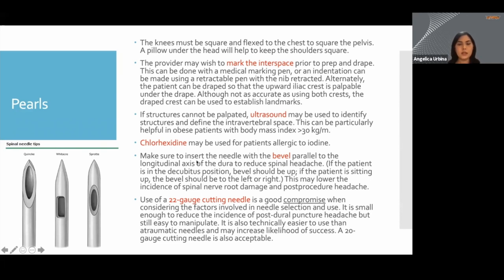Now let's talk about needles and the bevel of the needle. This needle here is classified as a cutting needle — the bevel is facing one direction. The easiest thing to remember when performing a lumbar puncture is to face your bevel towards the patient's flanks. The patient can be positioned upright, in lateral recumbent position, or even prone, so just remember to face your bevel towards the flanks.